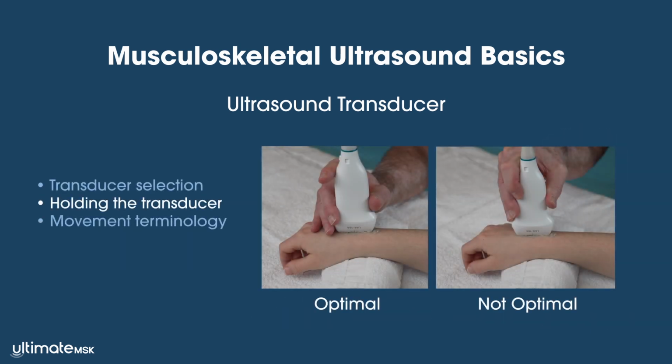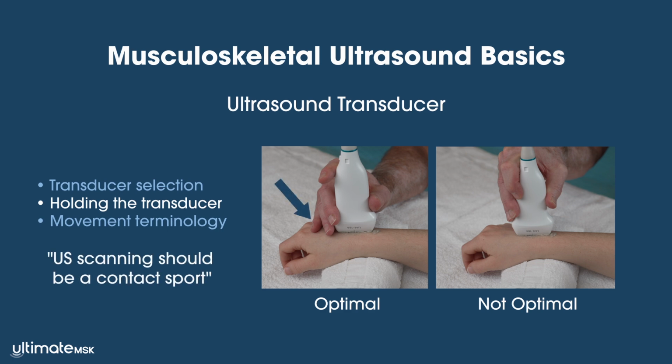How we hold the transducer during scanning is very important. A common adage is that ultrasound imaging should be a contact sport. This phrase emphasizes the importance of using your hand to stabilize the transducer by making contact with the patient, rather than relying solely on the transducer as the contact point. There may be some variation in how experienced sonologists hold a transducer, but the common denominator is that the hand serves as the primary stabilizer and not the ultrasound transducer.